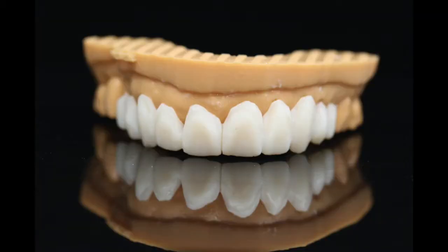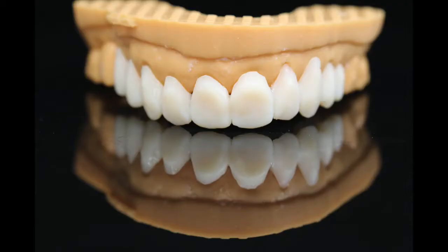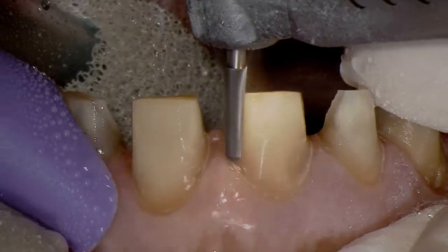In this case, they were made on the virtual prep model. I did not adjust or relieve it internally to seat better. But this just goes to show how you can preview multiple trial arrangements.